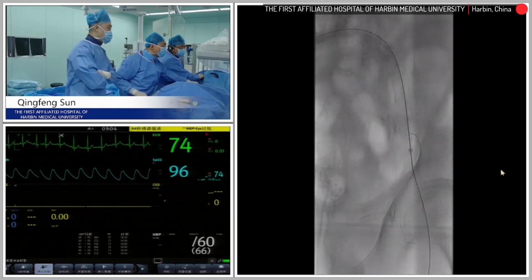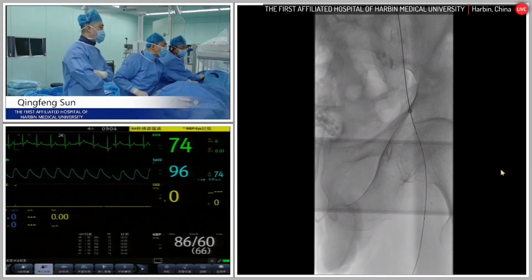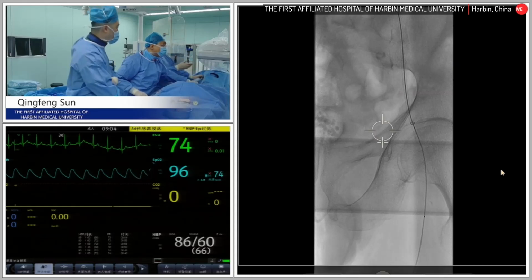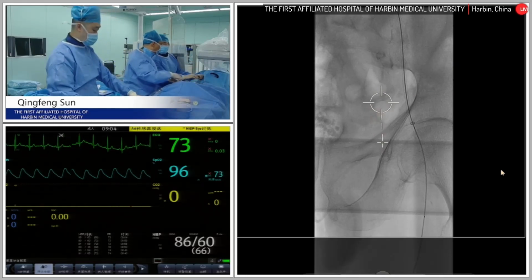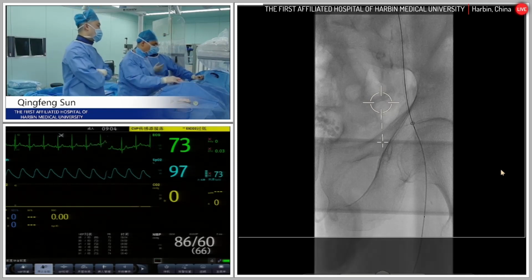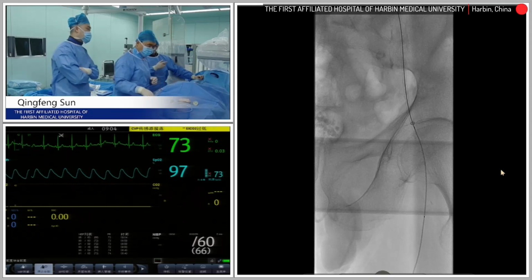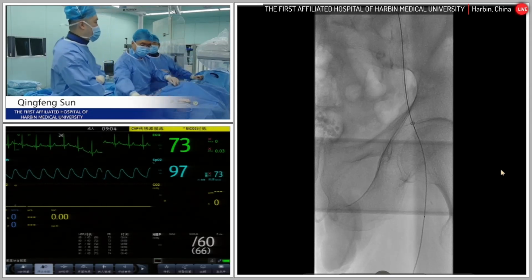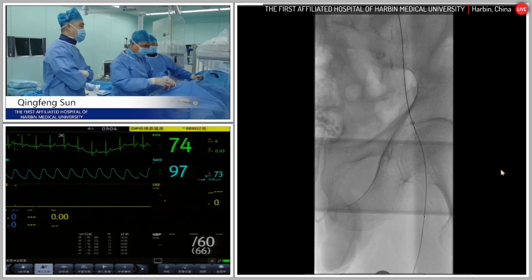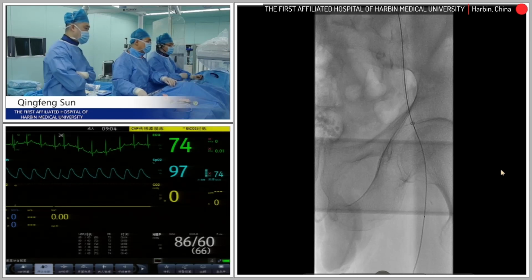No, because I think the stenosis may be based on thrombosis. Maybe debulking is very good, but this case is highly calcified, so it might be dangerous for the iliac. I think maybe a stent graft is okay for this case.